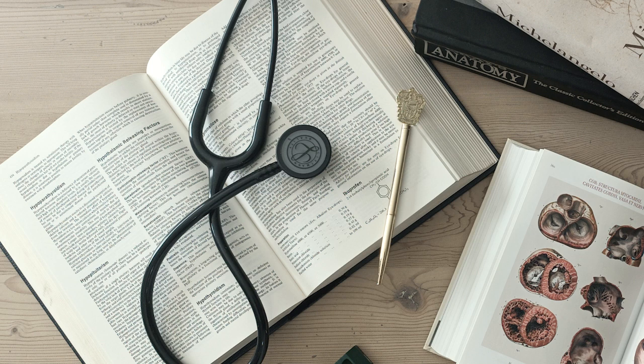You have to know these. Okay, lay them on us. What are the critical circumstances? First, a patient presenting with acute chest pain and a new, or presumed new, left bundle branch block, LBBB, should immediately raise suspicion for an acute coronary syndrome, specifically a potential ST elevation MI equivalent. New LBBB plus chest pain equals emergency.